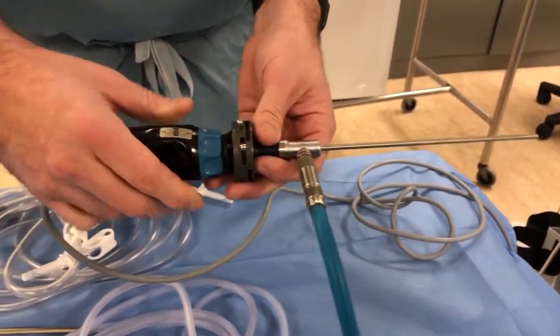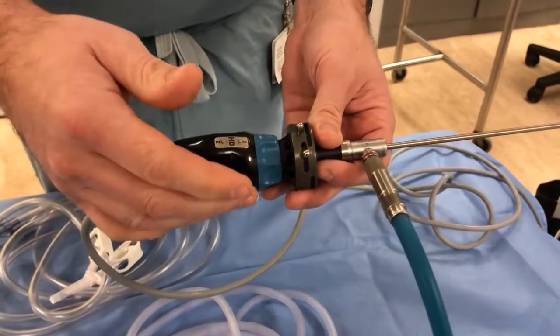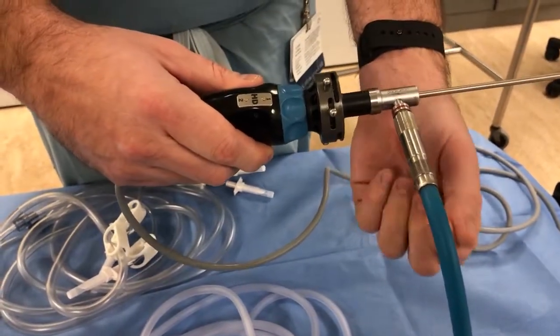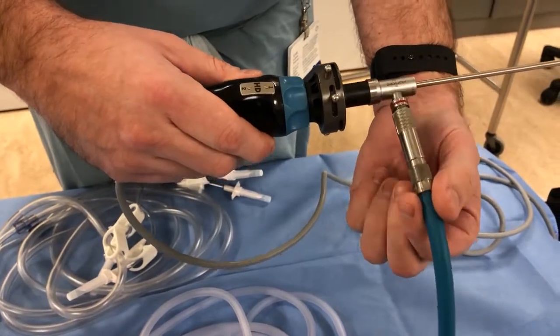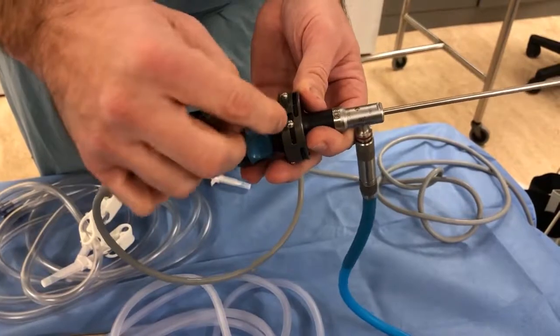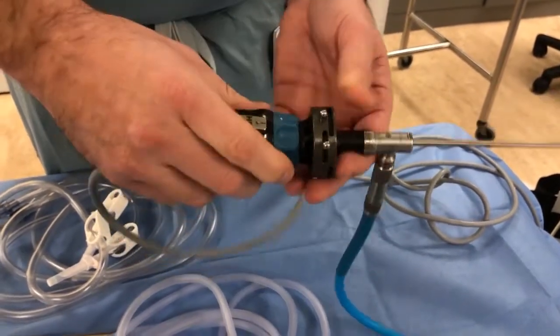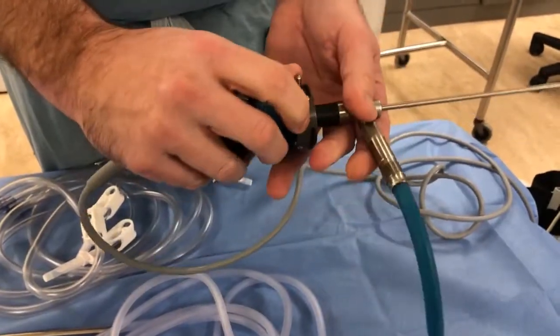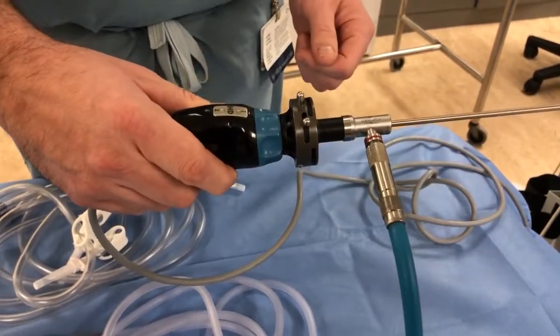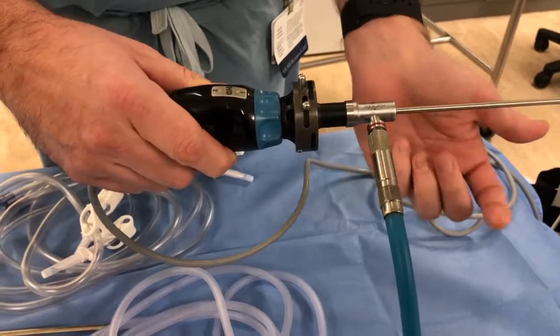As arthroscopes get older or things get adjusted, you may orient something to look at 3 o'clock and have it start falling down in the middle of the case. Most systems have a little nut you can adjust and tighten — by tightening this nut, it fixes the position with more friction to prevent that from happening.